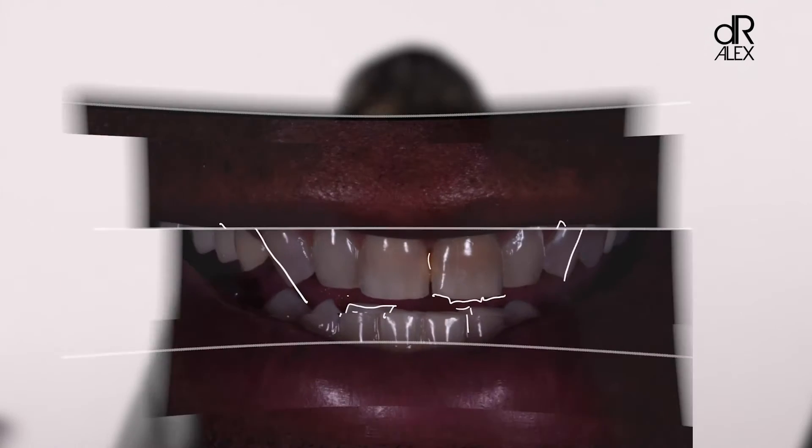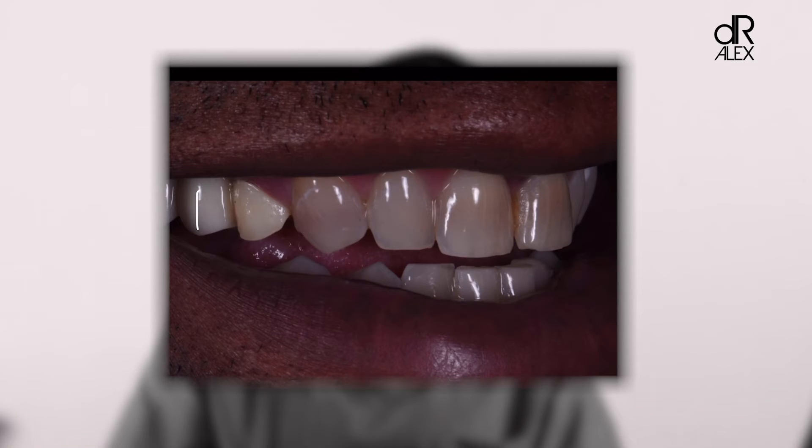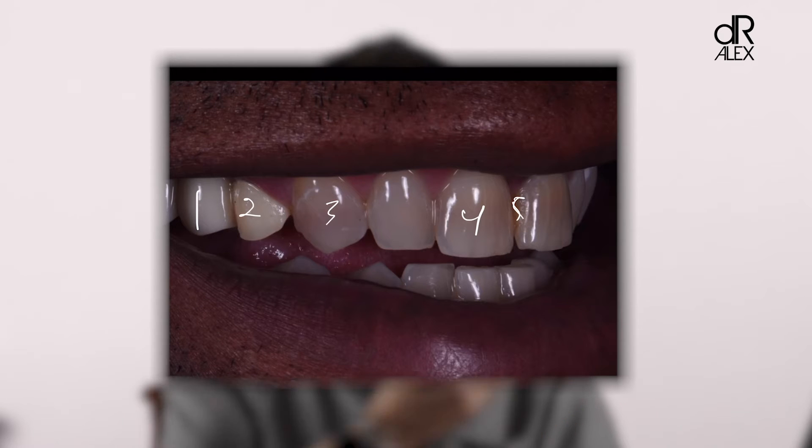Here's the side view, and what's important to see is we have one color, two colors, three colors, four colors — even five colors right in there. There are so many different colors in one individual smile that the harmony is completely missed and lost.